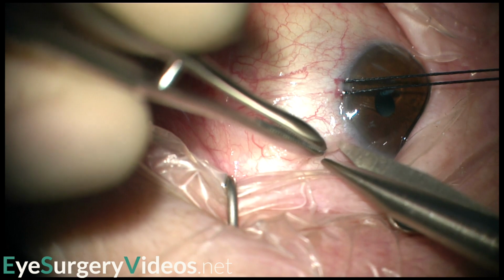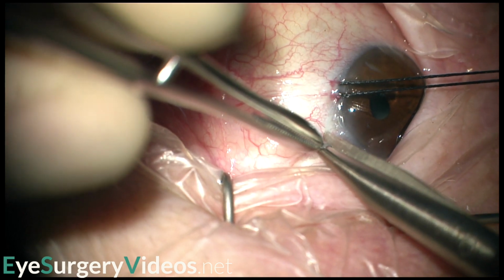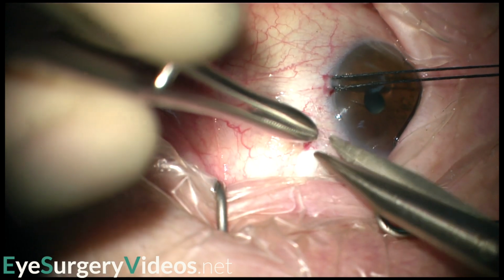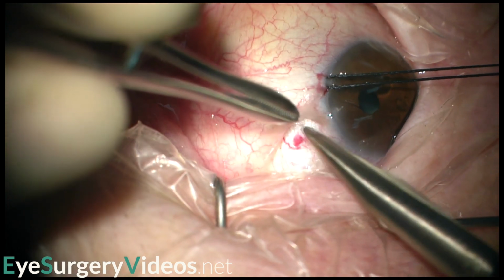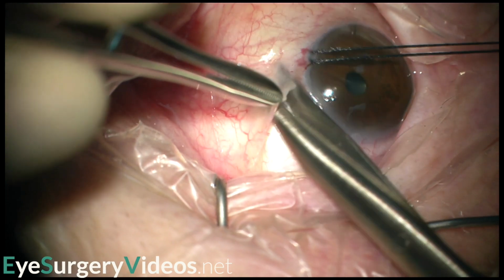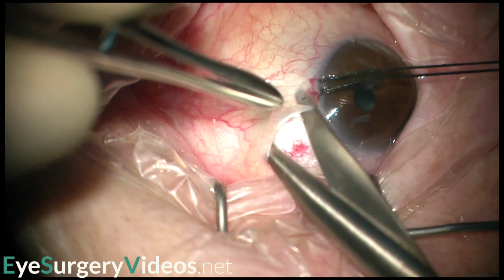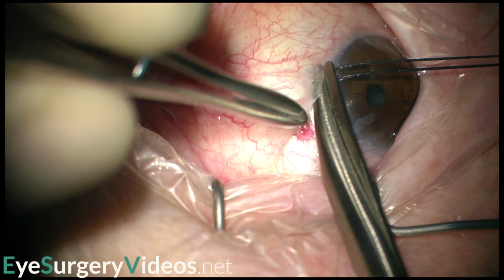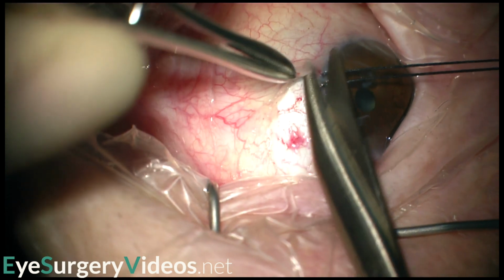A silk traction suture is placed at the limbus, and a peritomy is made to allow access to the superior and inferior borders of the medial rectus. Motor fibers enter the muscle between the middle and posterior 1/3 and are generally found on the innermost layer of the muscle. Therefore, these should be avoided using an anterior approach.